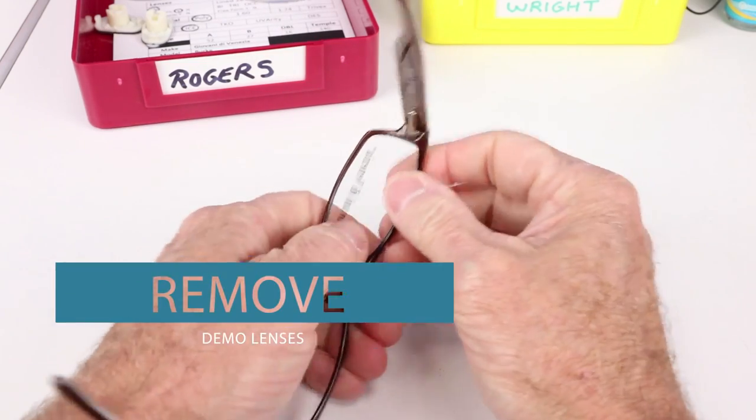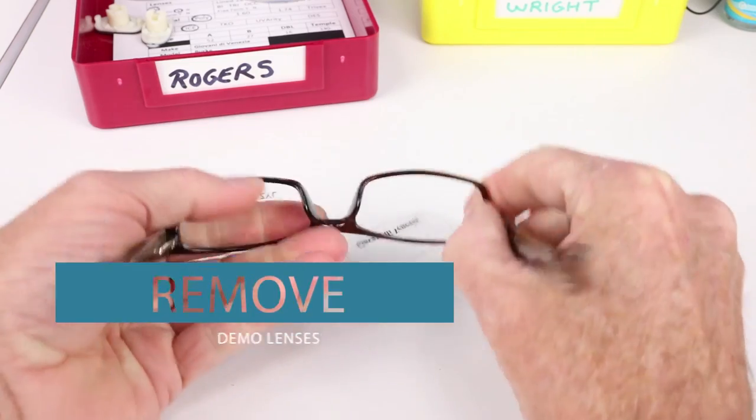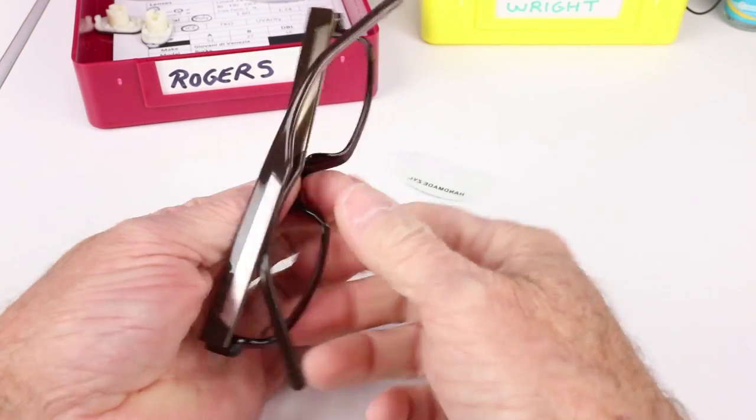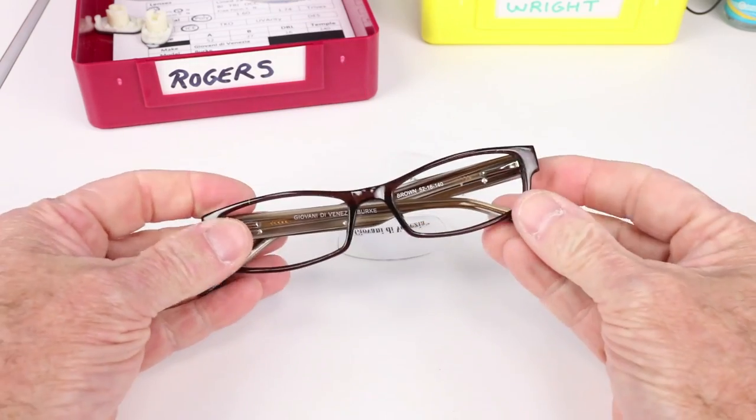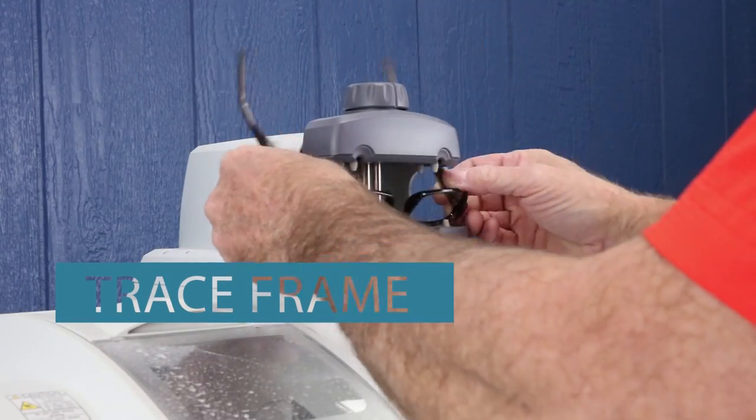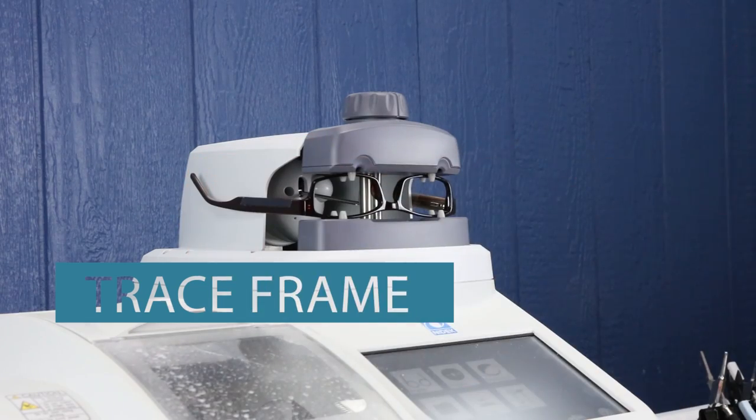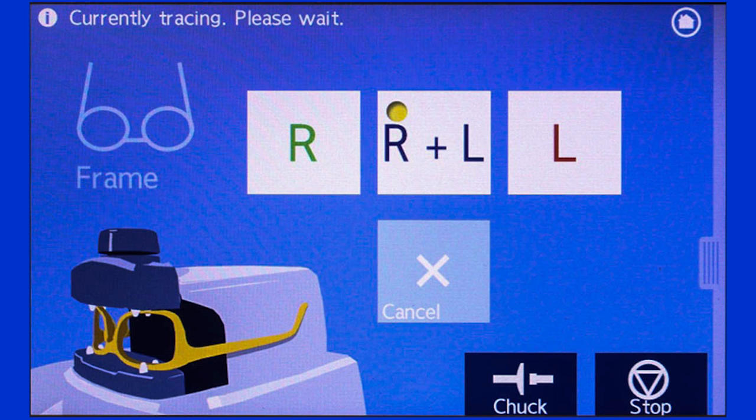Now's a good time to pop out the demo lenses. Just get your thumb back there. Pop and pop. Because now that those are out, it is time to do some tracing. Put the frame into the tracer, and choose any data information that you need depending on your frame type, lens type, and how you're obtaining the pattern information.